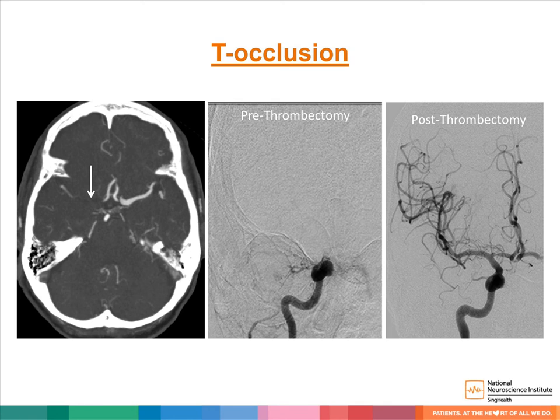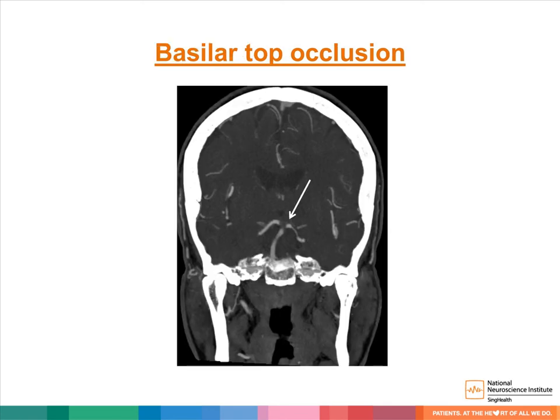The image in the middle is an angiographic image taken pre-thrombectomy demonstrating the T occlusion. The image on the right is an angiographic image taken post-thrombectomy demonstrating reperfusion. Ischemic strokes can also occur in the posterior circulation. In this example, we demonstrate a top of the basilar occlusion.